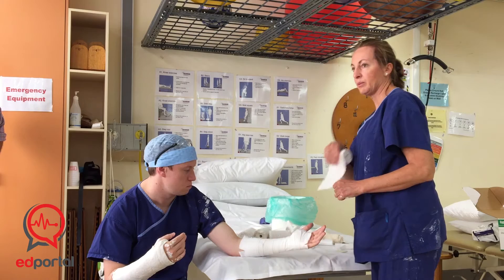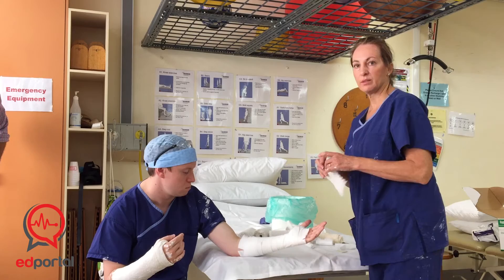You've got to look at a back slab as being first aid — it's temporary, it's while there's swelling. Once the swelling goes down, they'll come to outpatients and we'll replace it with a full cast.